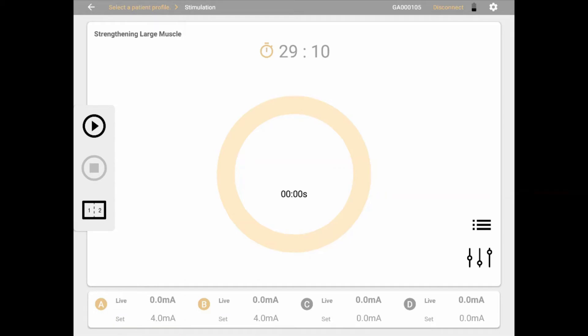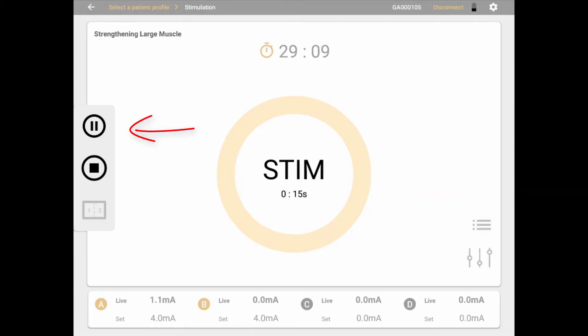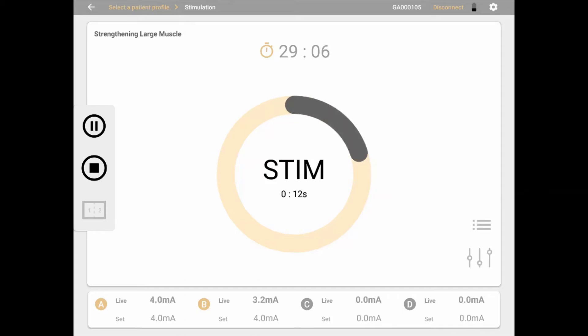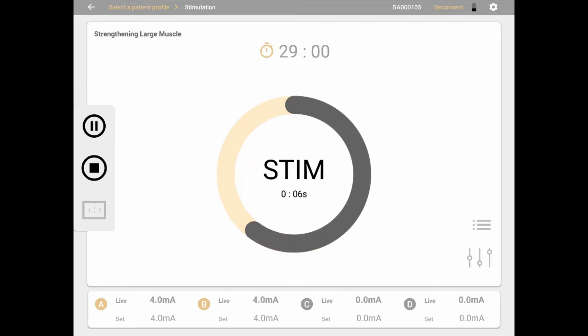Only when at least one participating channel amplitude has been set, the electrostimulation session may be started. After all settings are adjusted, click the Start button on the left of the screen to start a live session. You can follow the session on both the Mionics device and the app screen, and see the current phase and the time remaining, as well as each channel's live amplitude.